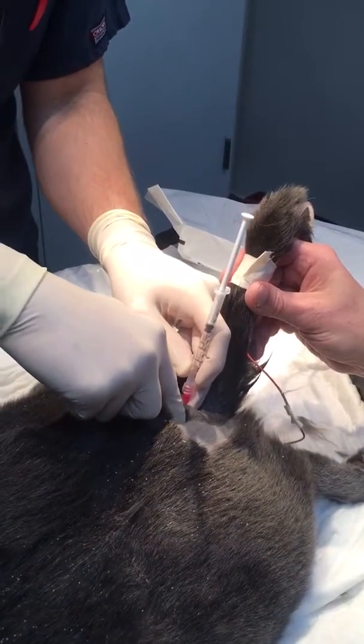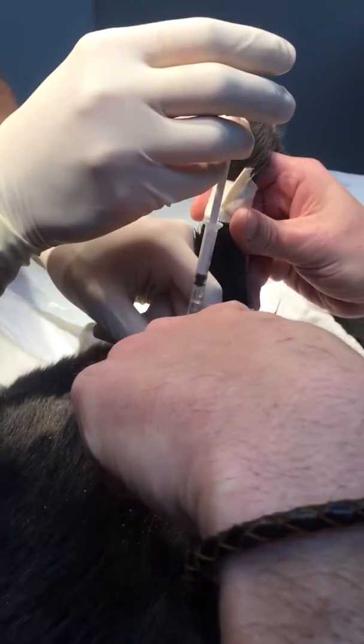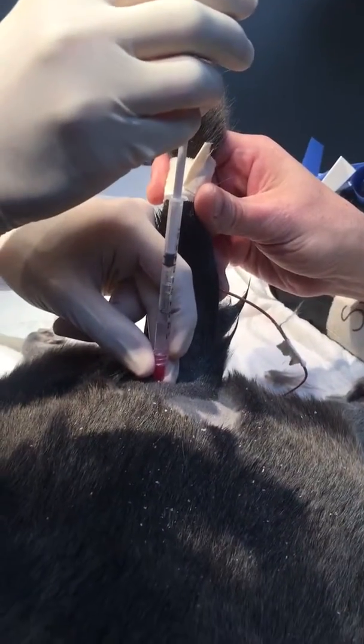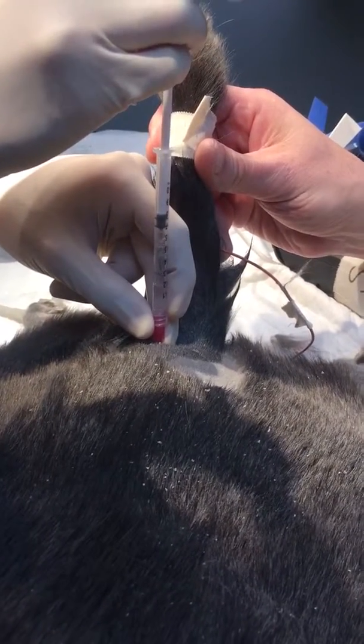Okay, so what you want to do — you'll know — because you want to gently depress the plunger, and you should watch. Once you push, that meniscus should keep going in. Push gently. Keep going. There you go. You hit the best place you can be — you're in.